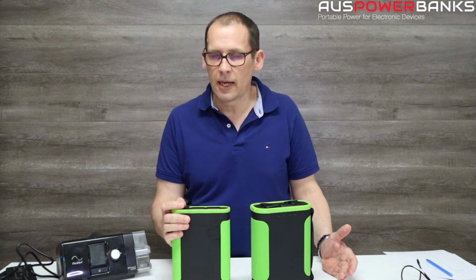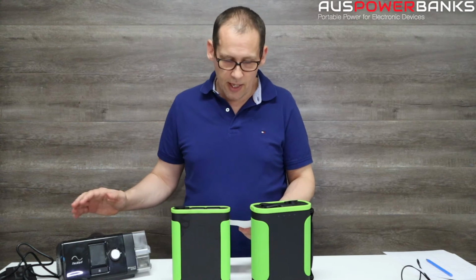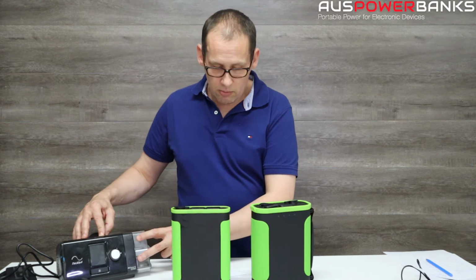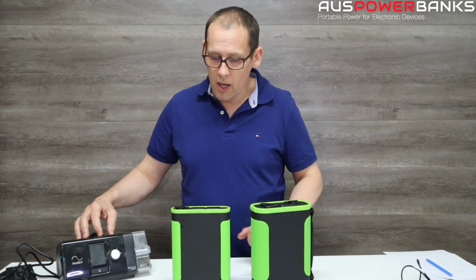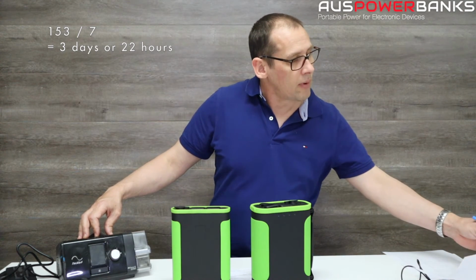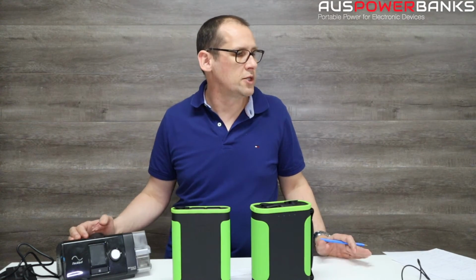the manufacturer's site. It'll give you a consumption guide based on your model. They all do. For example, the ResMed here, I just printed this earlier from the internet. Now this Air 10, for example, when just the CPAP is running on its own without the humidifier, it's using 7 watt hours, so that's basically 7 watts per hour. You divide the 153 by 7 and you come up with a figure of around 22 hours. So just running that portion of it's going to run for about 22 hours.